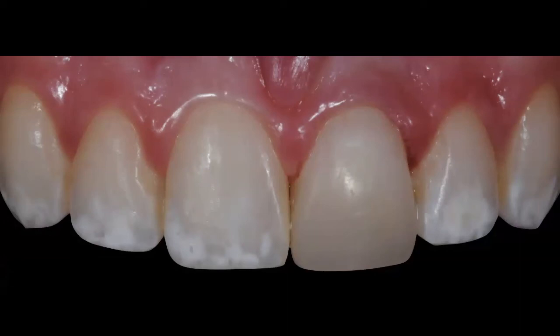But there's a lot that we did for this patient before we got to this. This is a temporary class 4 restoration that I had fabricated for this patient. And there's a long story why I decided to do a class 4 composite temporary restoration before I did my final ceramic restoration. I'm not going to go into the details.